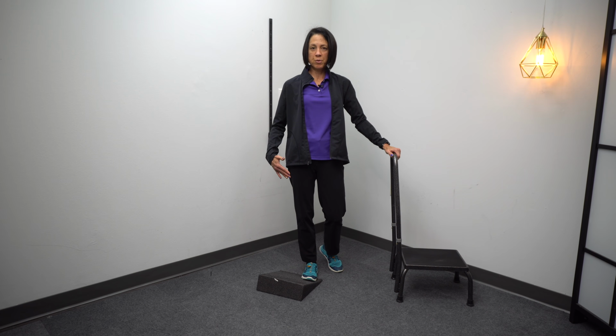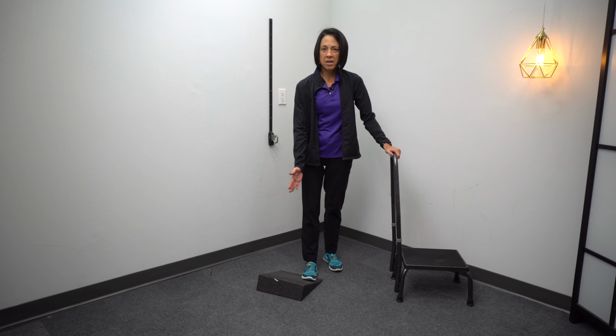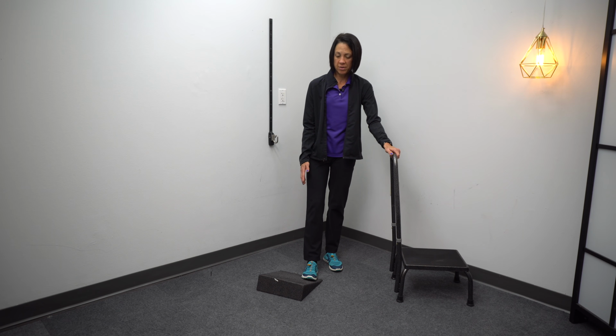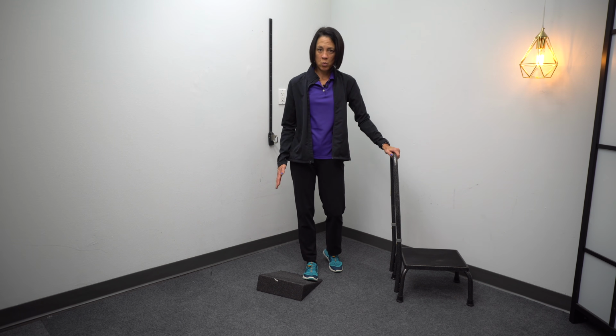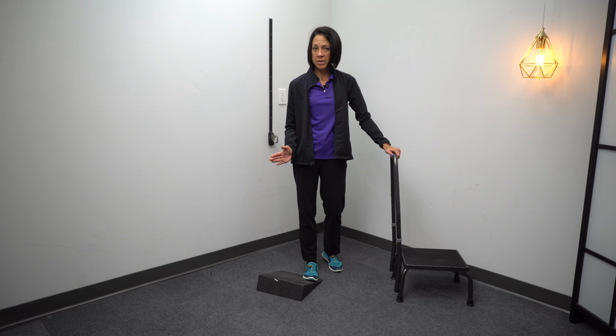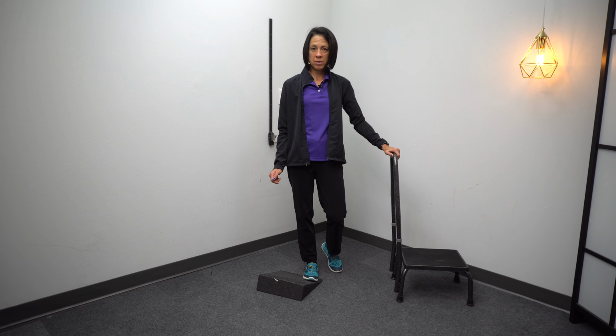Now I'm showing this to you from the front so that you can see the angle of the wedge. So we did it straight on in the front, we did it straight in from the side. Now we're off at that 45-degree angle with the wider side angled out more towards the pinky toe. And then you're just going to lean forward, push your hips forward, and again you want to hold this for 1 minute.